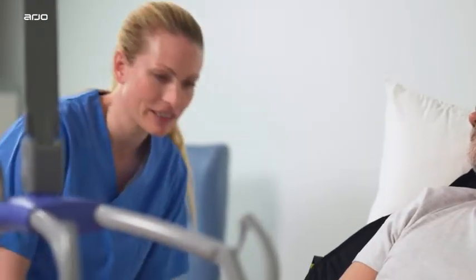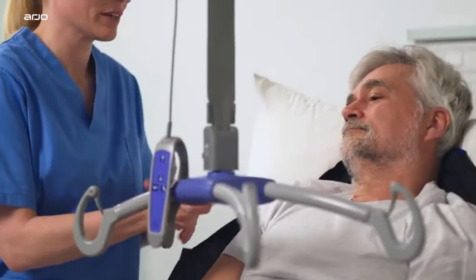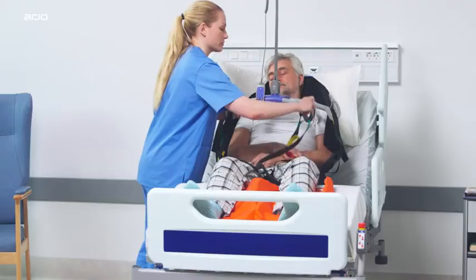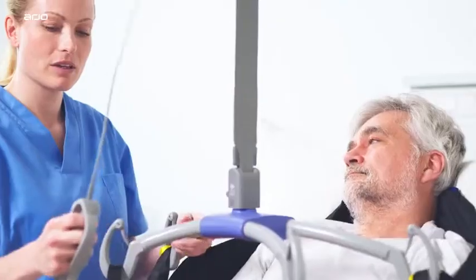When attaching a loop sling to the loop spreader bar, always ensure that the sling attachment loops are installed correctly into the retaining hooks. Use Arjo loop slings with the loop spreader bar.